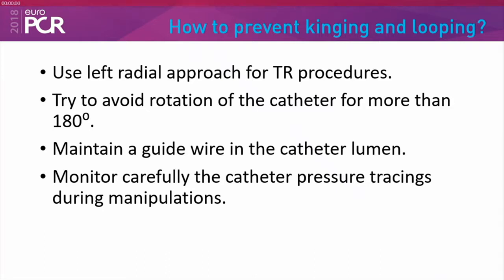And pressure dampening is the most important thing for any interventional cardiologist to understand. Whenever you see the usual pressure dampening all of a sudden, then there is a chance of a knot somewhere. And a 6 French guide catheter, this is the first time I have used it, because all other techniques had failed. So this may be a new arena to understand how to unknot these.